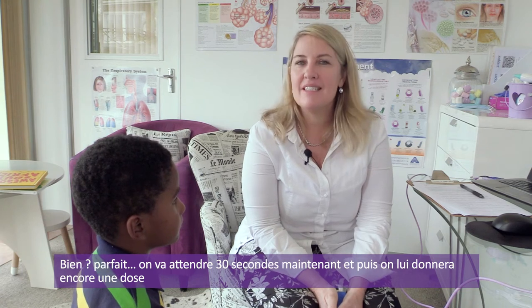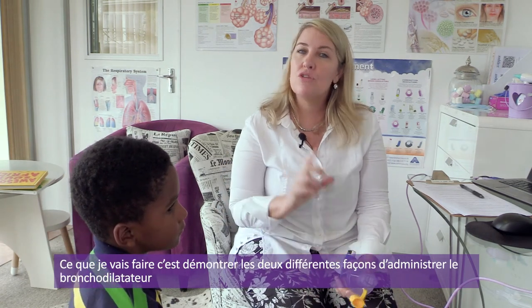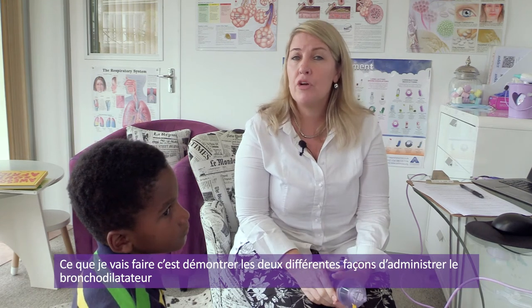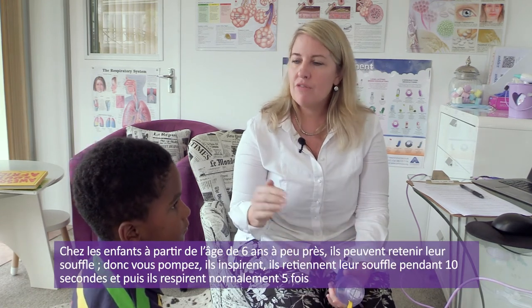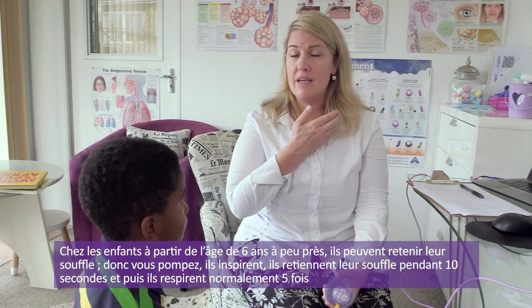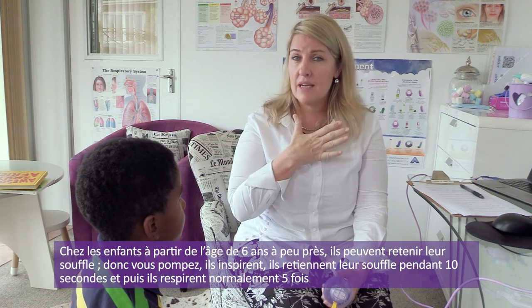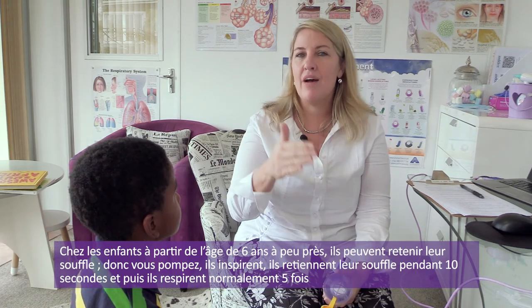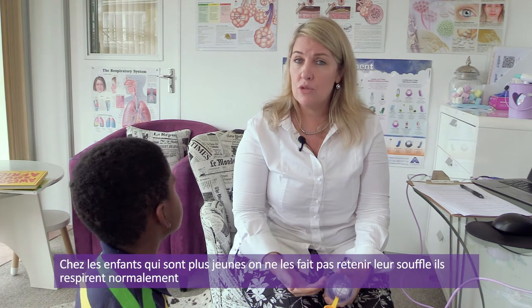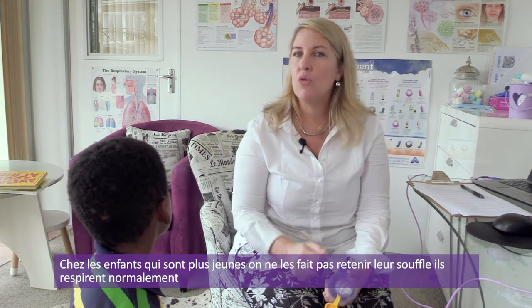Fine. Good. Okay, so we're waiting 30 seconds now, and then we'll give him another dose. Now, what I'm going to do is demonstrate the two different ways of administering the bronchodilator. So in children from around about 6 years and above, they can do the breath holding technique. So you spray, they inhale, they hold their breath for 10 seconds, and then breathe in and out five times. In younger children, they simply do tidal breaths. You don't get them to hold their breath.